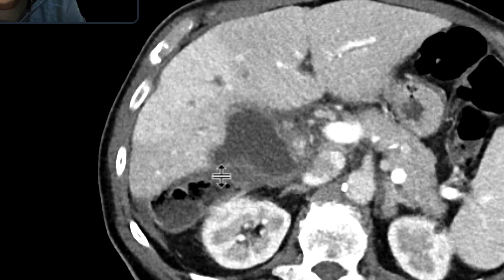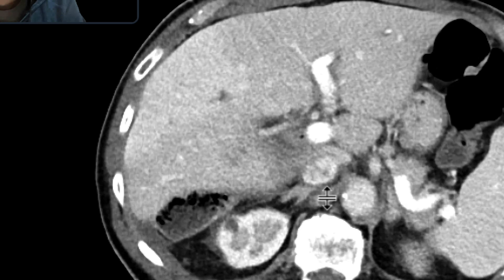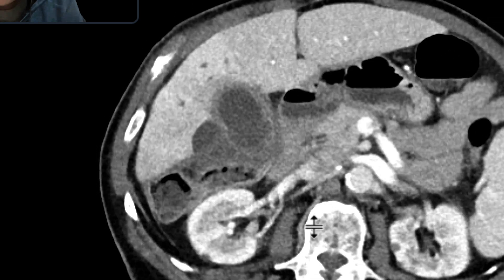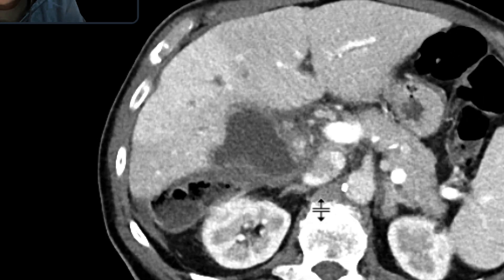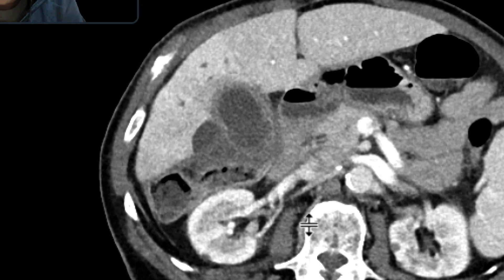There is a perforation right over there with a collection that has formed, abutting a portion of the liver.